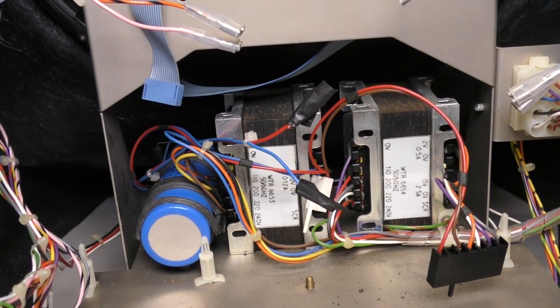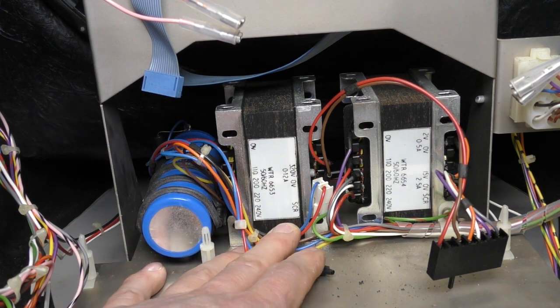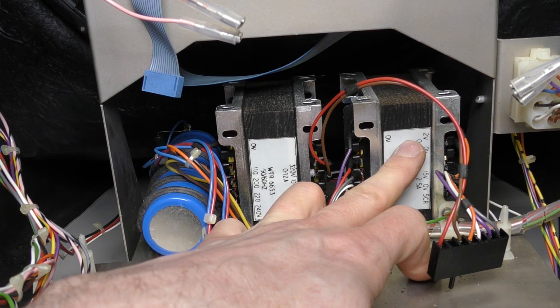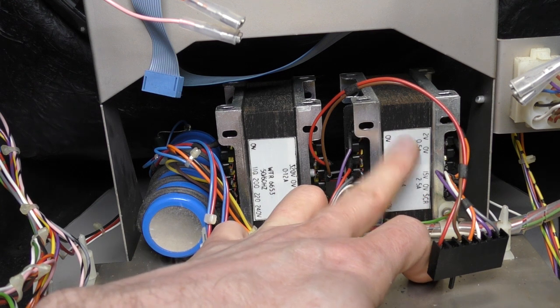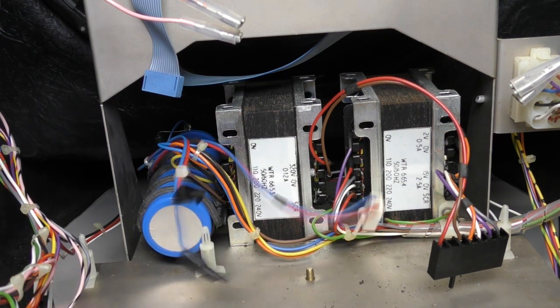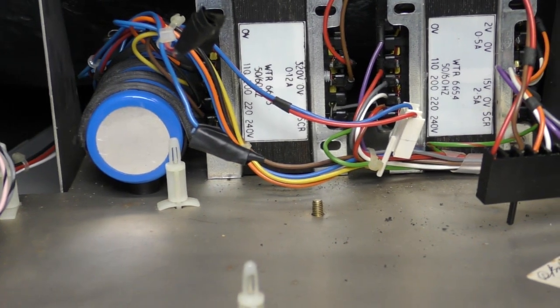Inside the back we've got the flash capacitor, 330 microfarads at 400 volts, and two main transformers. One is for low voltage stuff here, which is 15 volts, but it also has a 2 volt winding, and that's for that tiny little bulb for the fibre optic thing, which seems to run at 2 volts. I'm not sure if any of the other bulbs run on that supply, but it seems interesting. They've got a winding especially just for that tiny little bulb. And this is for the flash, this is 320 volts. They both have multiple primary voltages, with a voltage selection switch on here, which was the way you did voltage selection in the days before universal input switch mode power supplies.